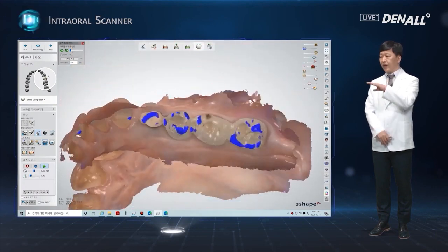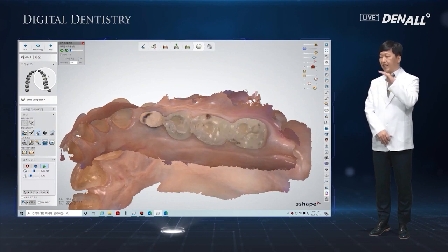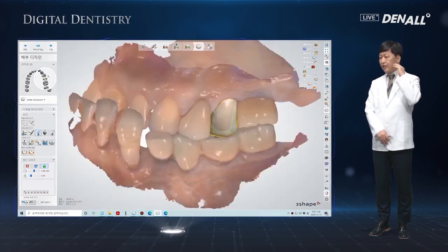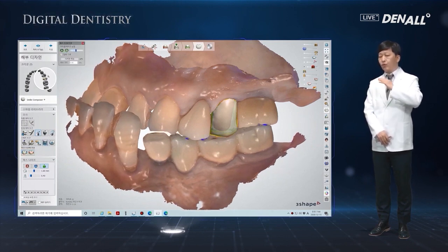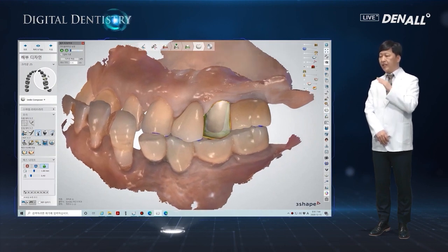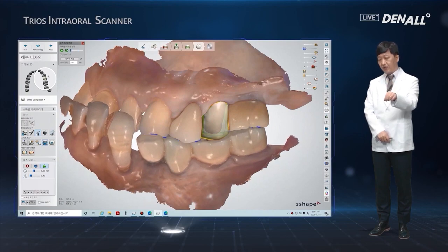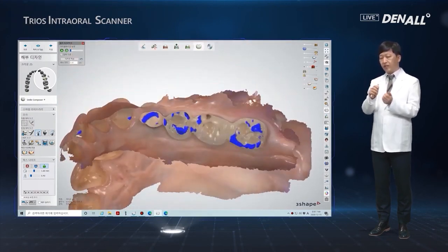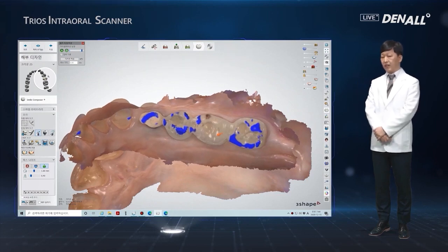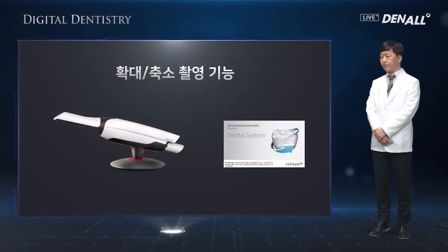After crown design, the guide is reproduced and the guide can be applied to the design, automatically eliminating the occlusal interference that occurs during lateral occlusion. If you use the function at the stage of setting the prosthesis later, the time taken for occlusal adjustment is considerably reduced, especially for the lateral guide.